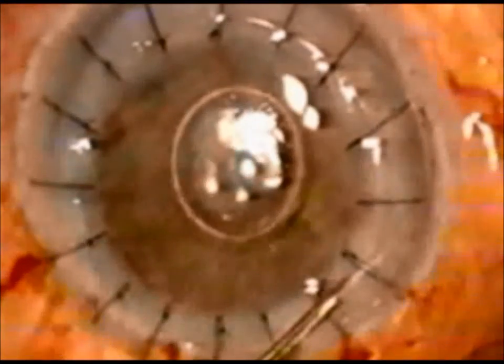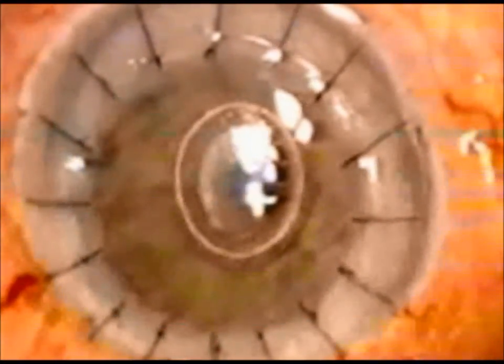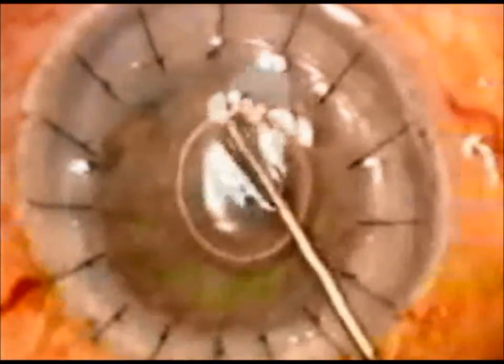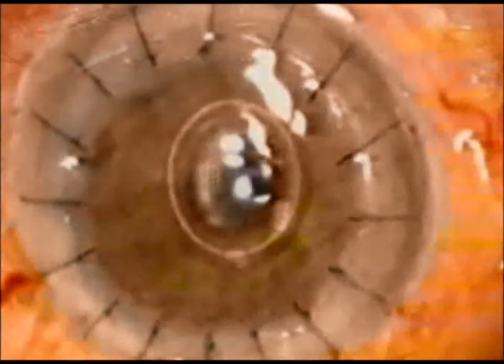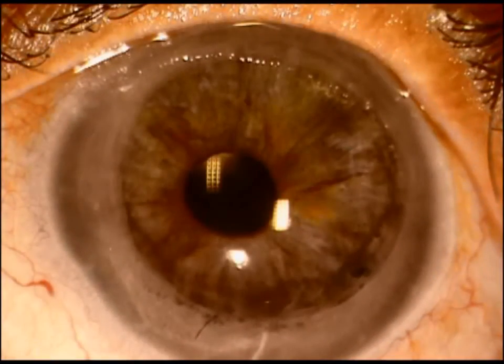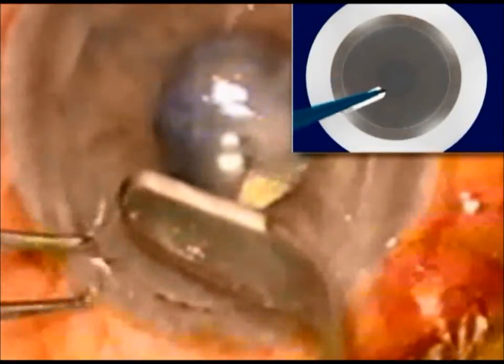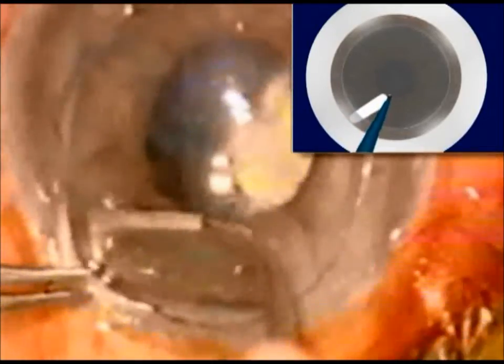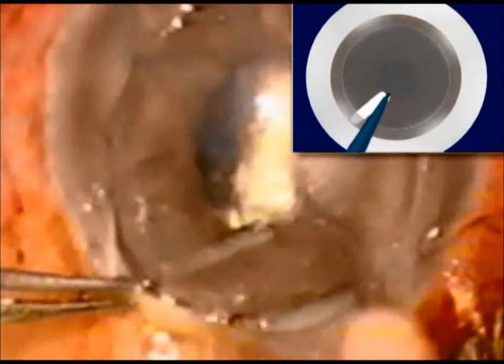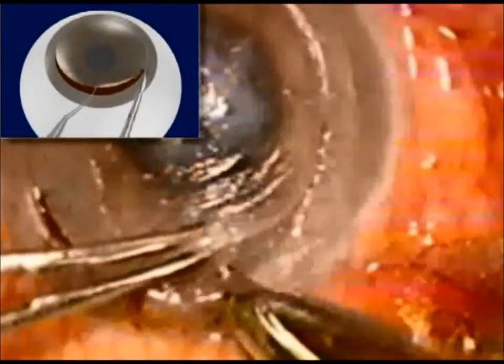Sixteen interrupted sutures are placed to secure the graft to the host. With this peripheral intrastromal tuck, sutures can be removed as early as three months after surgery. With this technique, we are able to combine the benefits of a lamellar surgical procedure with those of a full-thickness keratoplasty.